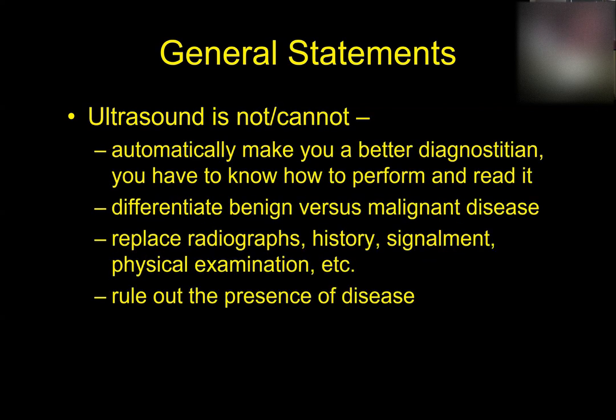What is the opposite of what ultrasound can do for you? Obviously, that would be what ultrasound can't do for you. And the first one I think is really important. Just because you go out and buy an ultrasound machine and have it sitting in your practice doesn't make you a better doctor or a better diagnostician. You have to know how to do ultrasounds. You have to learn how to do it. And some practitioners find the learning curve of how to do ultrasounds relatively steep.